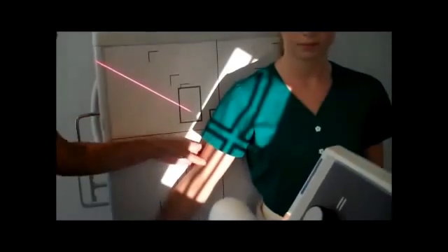For the next projection, we'll do the lateral. The patient will internally rotate and place the back of the hand on the hip.